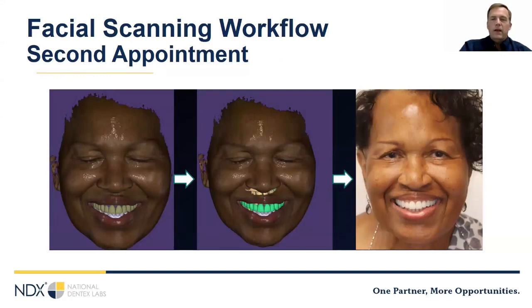With this process, you can predictably deliver exactly what the patient saw at the virtual try-in every time. And again, I'm showing you the facial view, but you can turn this however you want. It's just like any other three-dimensional model, so you can look at a profile view and whatever. As far as I know, there's some research been done on dynamic facial scans, but I don't know of any that have been released commercially yet. But whatever scans you take, your laboratory can stack them all together and go from low lip to look at the incisal edge position to high lip, look at the buccal corridor, everything.